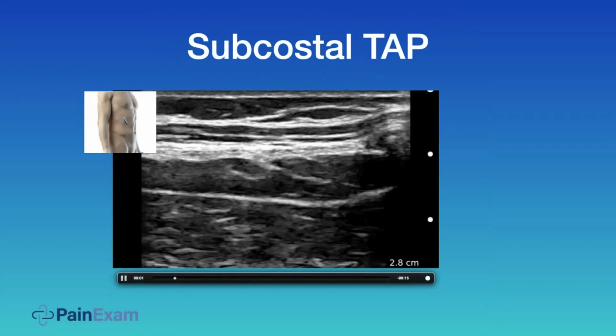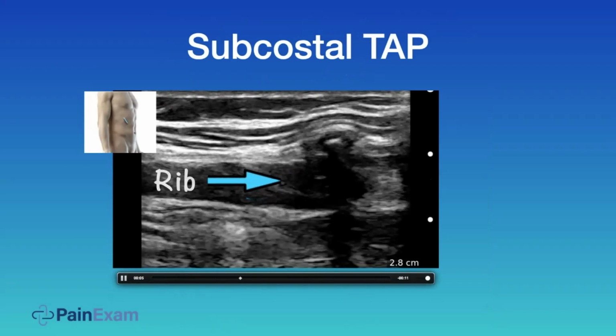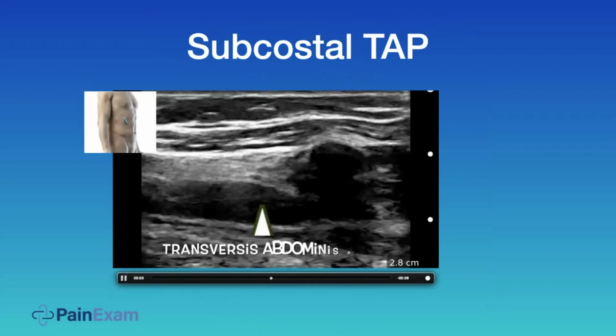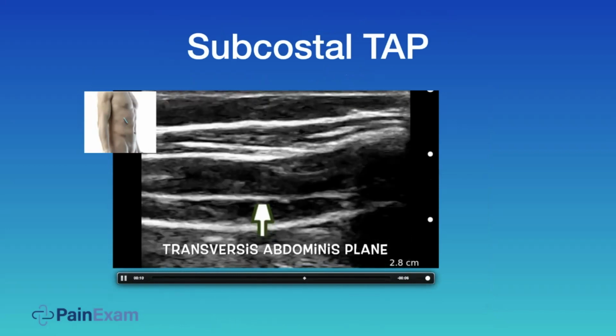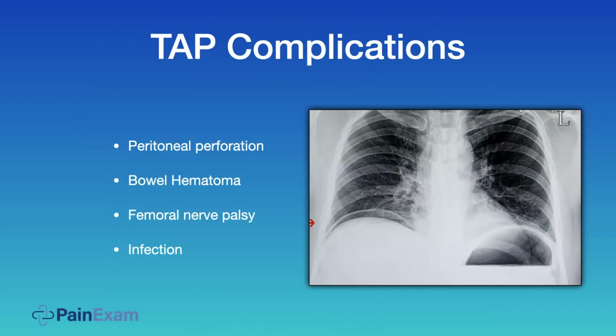Subcostally, sometimes we have patients who have pain underneath the rib, anterior lateral in that belly wall. It's maybe because they have a jejunostomy tube or a PEG tube that's painful. And here is the plane that you're working in, okay? It looks like the other TAP plane, but we're just under a rib. I have patients who've had PEG tubes placed, and the gastroenterologist probably injures the intercostal nerve and causes chronic pain, or the nerve becomes entrapped from the equipment that they put in.